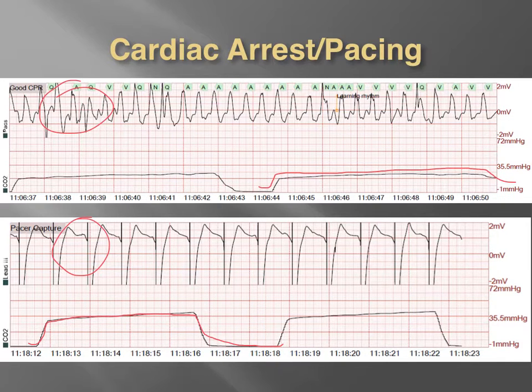Okay, so this pacing was actually causing the heart to contract better than our CPR would, which shows, one, CPR, no matter how efficient we are, is not always the most efficient, and two, may give a better cause for providing pacing in certain situations, say in an asystolic patient where CPR may not be the best answer. It's always possible that someone went into cardiac arrest because some kind of pacing mechanism of the body just wasn't working right.